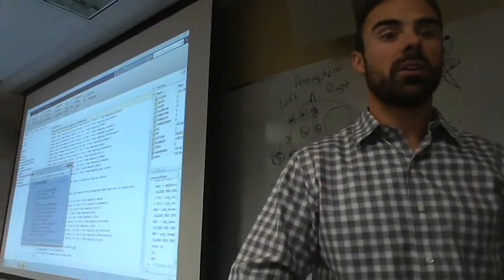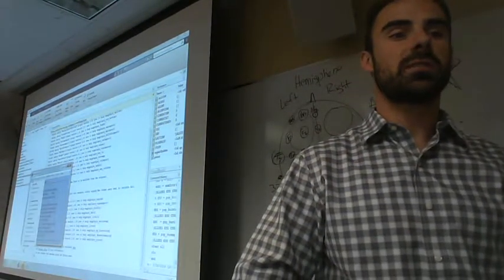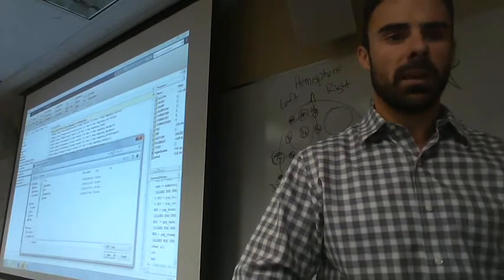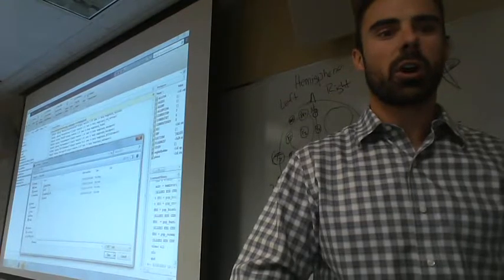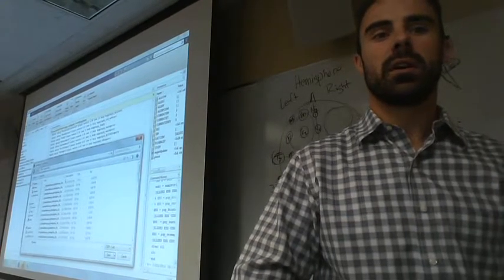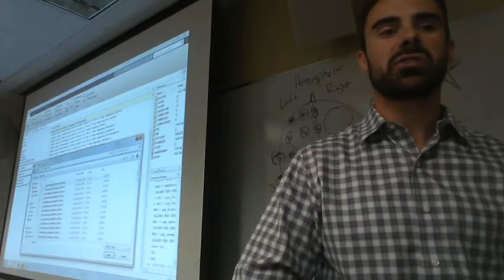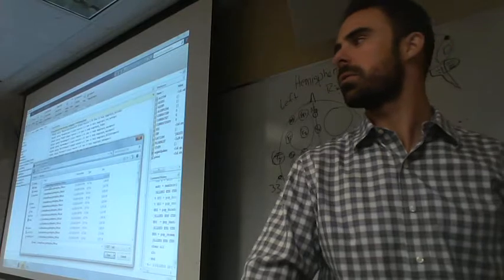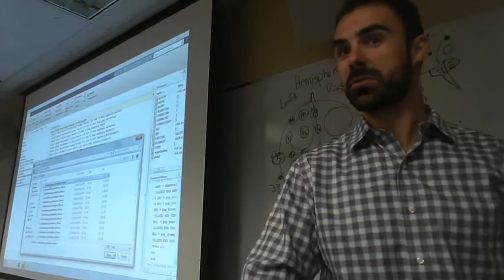All right, so now let's load up a set of data. So you go File, Load Existing Data, and we will go to our basic EEG files, which is what we downloaded today. All right, and so we're going to grab one of these. Let's just start like Drake at the bottom with the lowest number, 3. Okay, that's where Drake started.